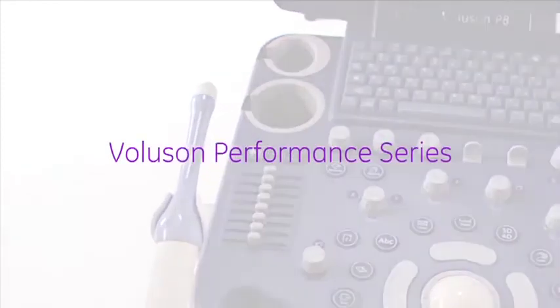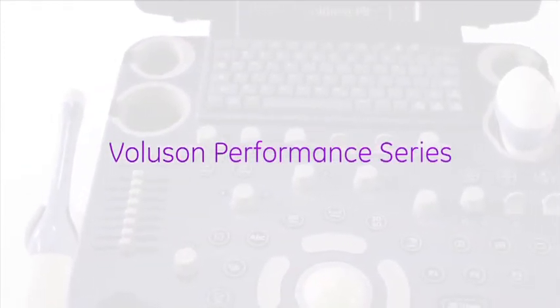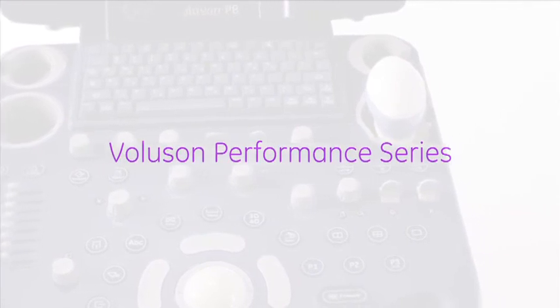The Voluson Performance Series is an easy-to-use system with excellent image quality and performance to help meet the needs of your clinical practice.